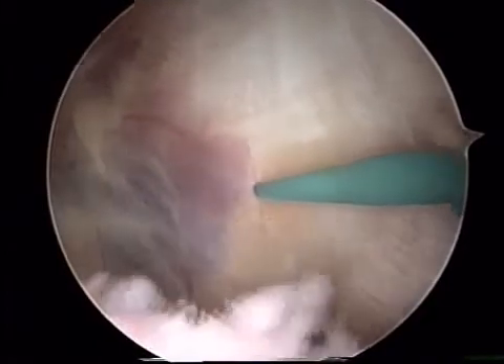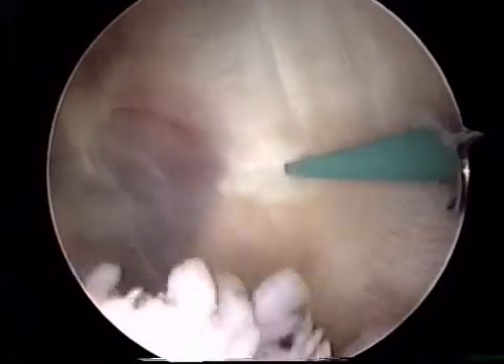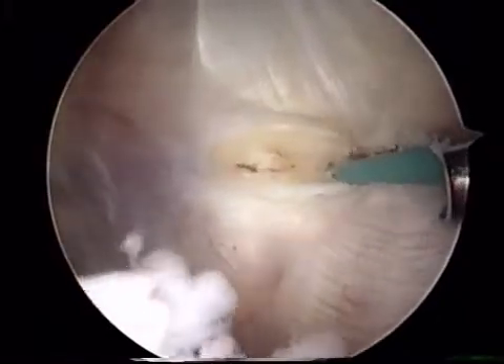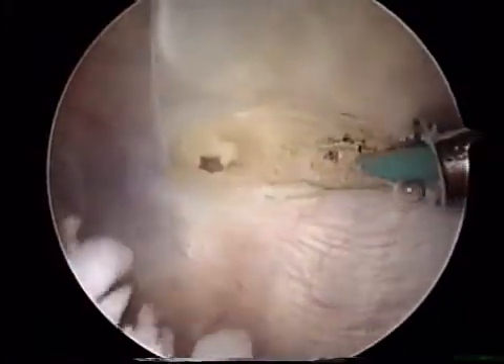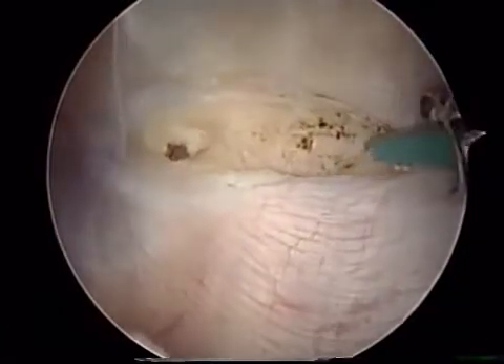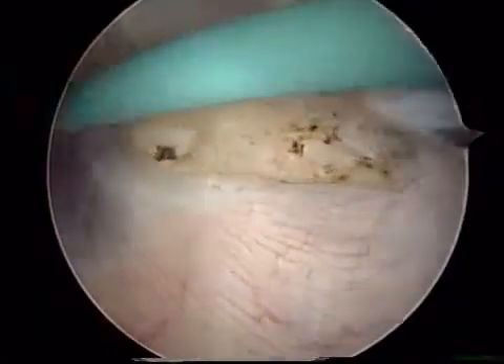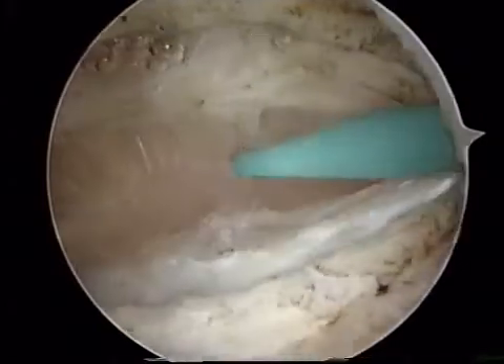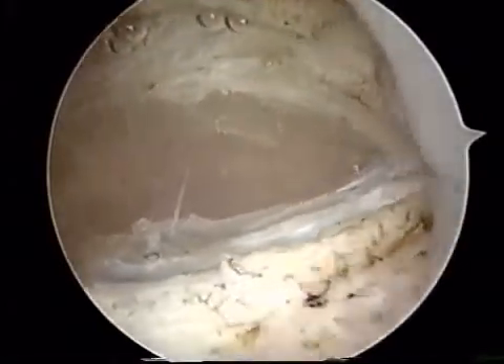Here we are looking into the suprapatellar pouch. We have introduced an electrocautery device to cut through the lateral retinaculum from the inside out. This is beneficial in that we do not need to make an additional incision through the outside part of the skin. This allows the patella to be loosened on the outside part of the knee.